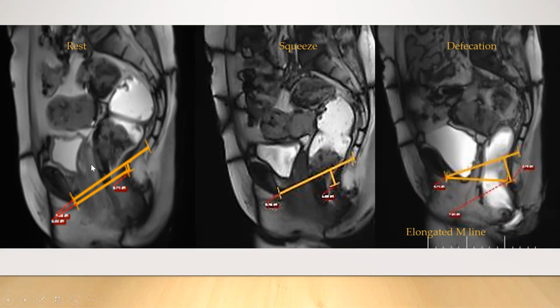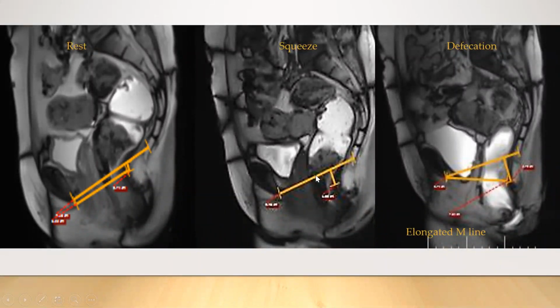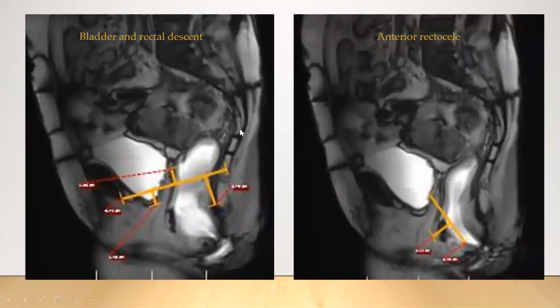We can identify here that this patient is post-hysterectomy. You can just identify the vault over here. Please note that the vault is always located above the level of the pubococcygeal line, so it has never really descended down. So there is no prolapse of the middle compartment. As the patient performs the defecation maneuver further, you can identify again the same thing, the rectal descent which is happening over here.